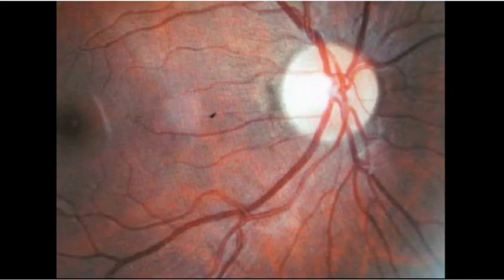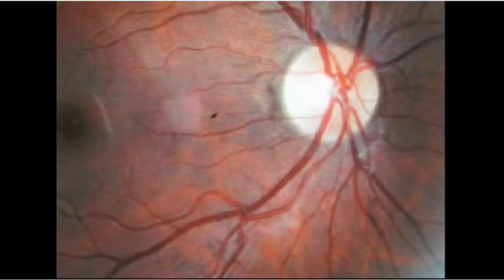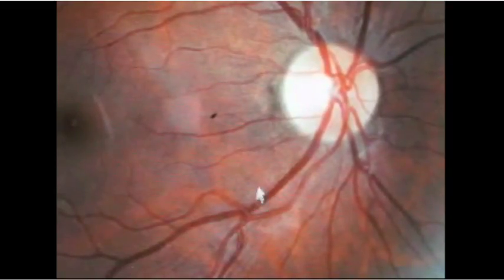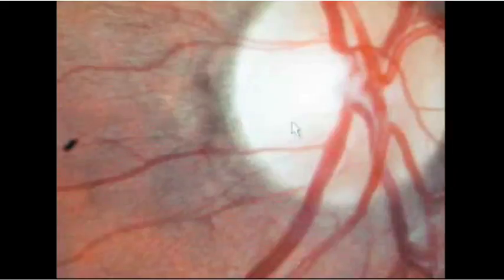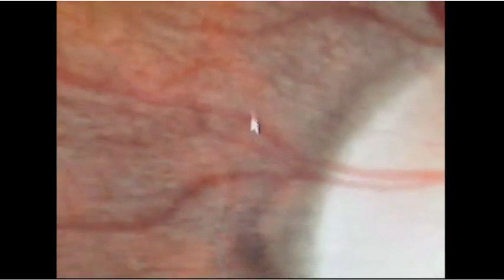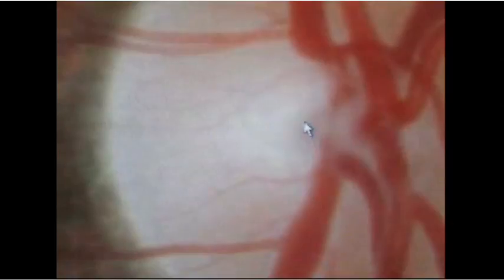What I'm going to do is demonstrate how accurate the fundus camera is by increasing the magnification. And you can see that even as I increase the magnification, I have a very, very good view of the retina and I can easily see if there were any microaneurysms there. And I can easily see the cupping of the disc.